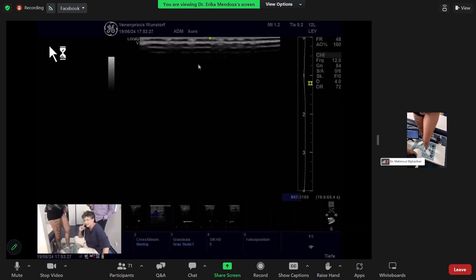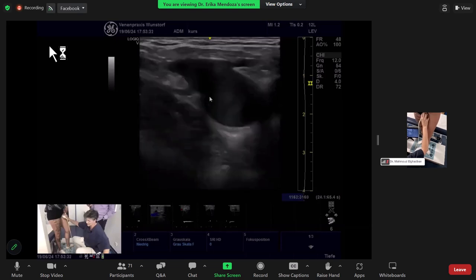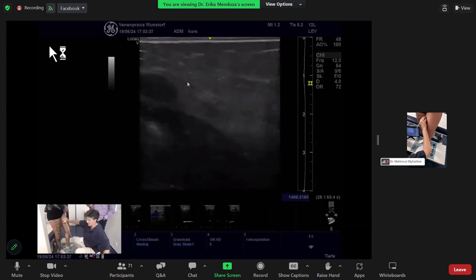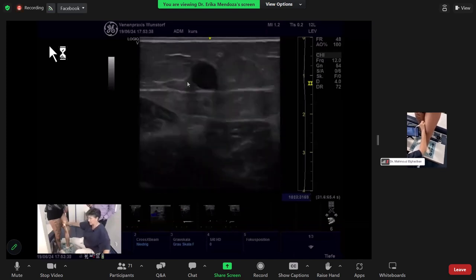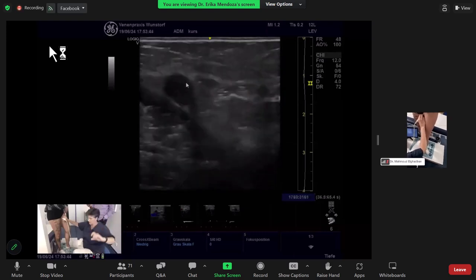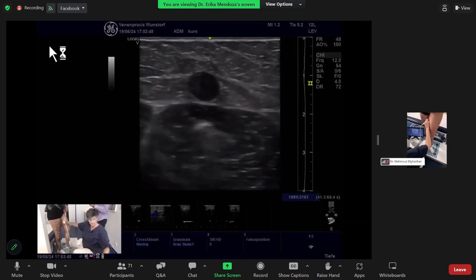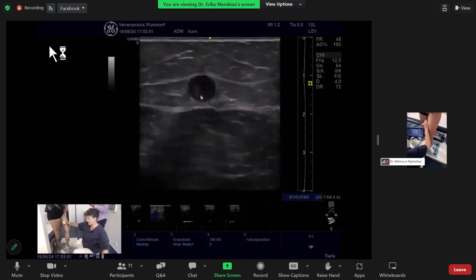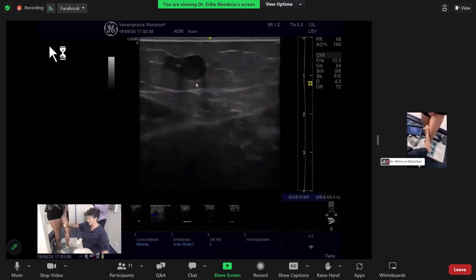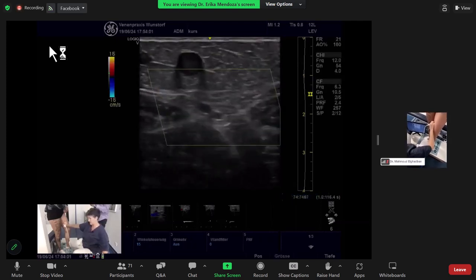So in this case, or in both legs, as we have a reflux from the deep vein, I would close the great saphenous vein below the terminal valve, because it's a young lady and I don't want to be cutting the leg and so on. Again, in this case, we have the tributary going out of the fascia. Here we have a little perforating vein, which is great. Have a look.